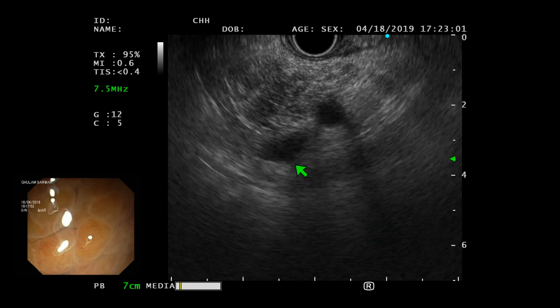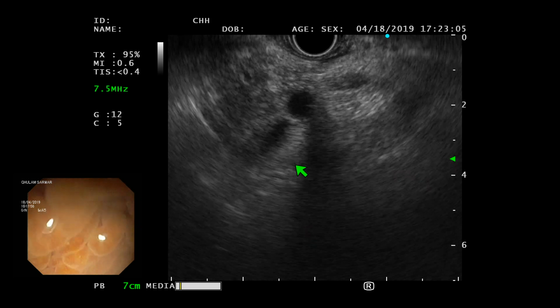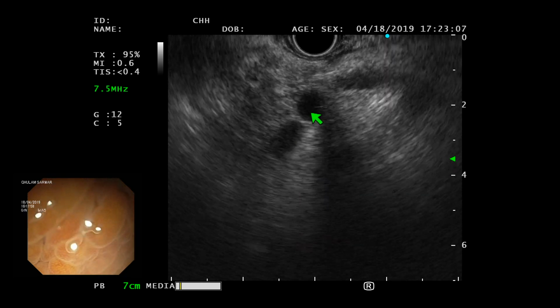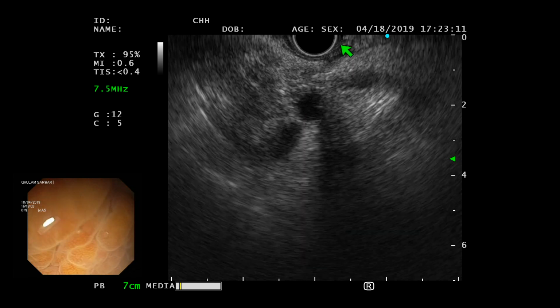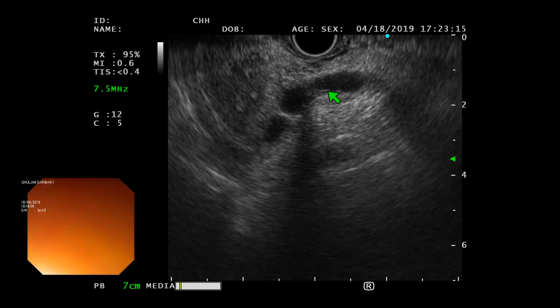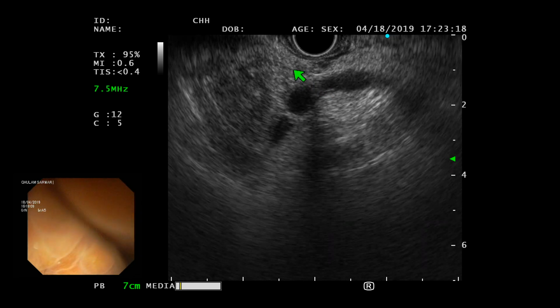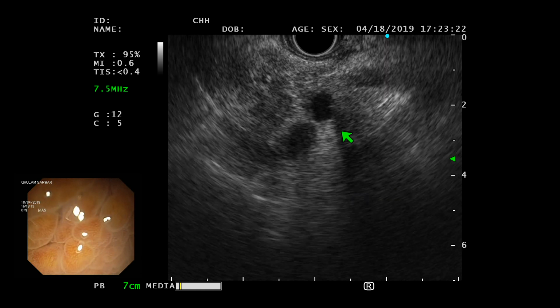Now this splenic artery and splenic vein, they shouldn't be here. They should be in this area. Splenic artery has a zigzag course. That's acceptable if it's even here or there. But the splenic vein should be right in this position.